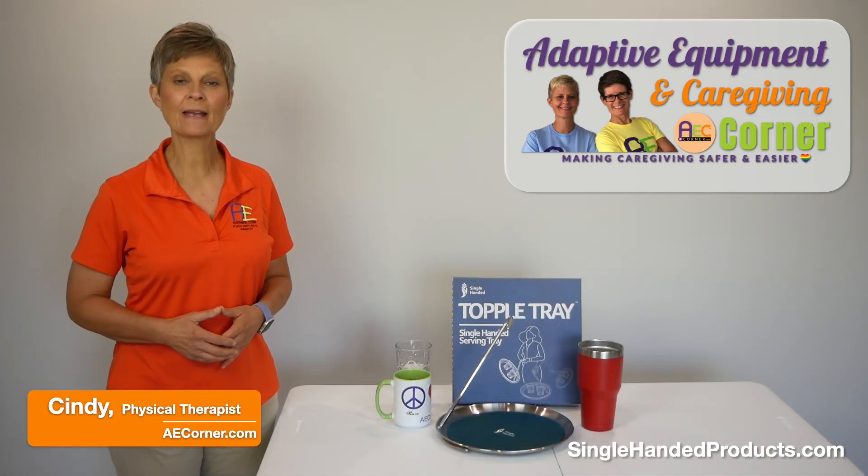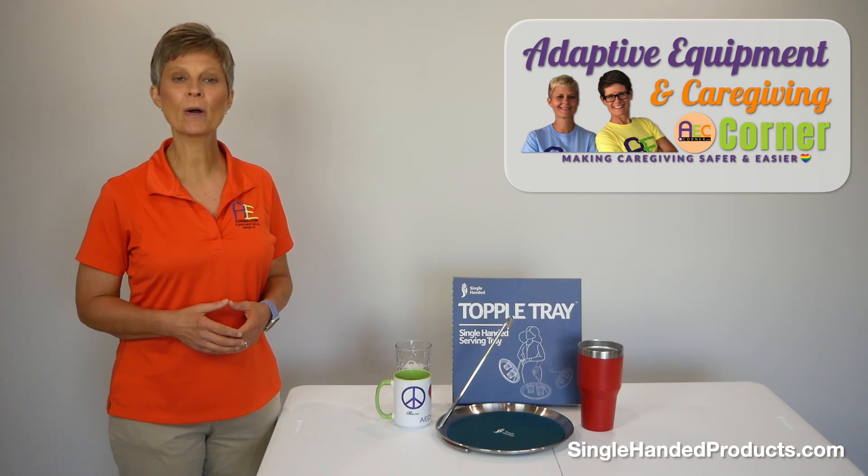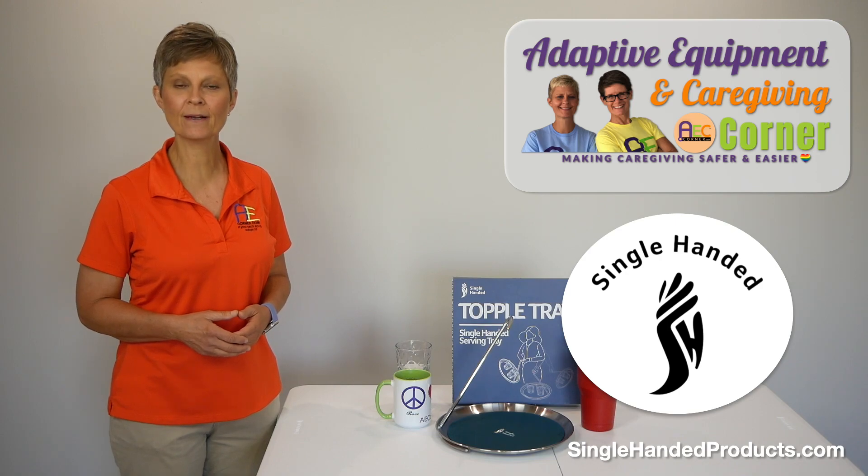Cindy here, Physical Therapist with Adaptive Equipment and Caregiving Corner. Today we are going to take a look at a product called the Topple Tray, sent to us by the kind people at singlehandedproducts.com.